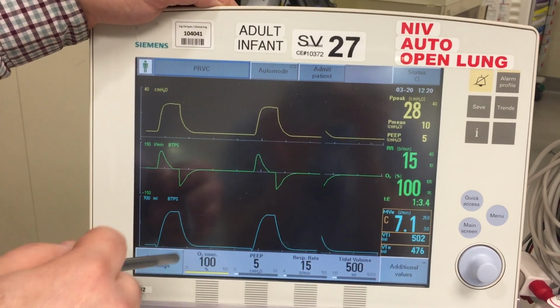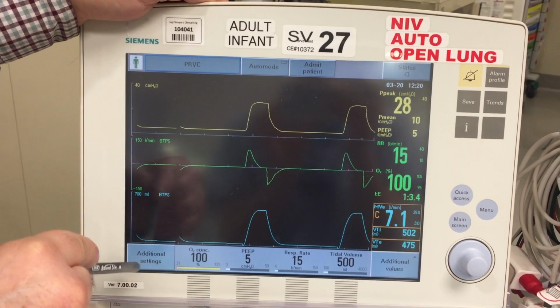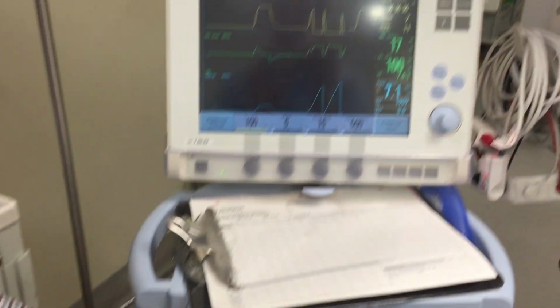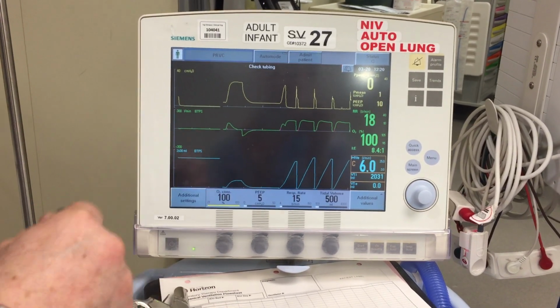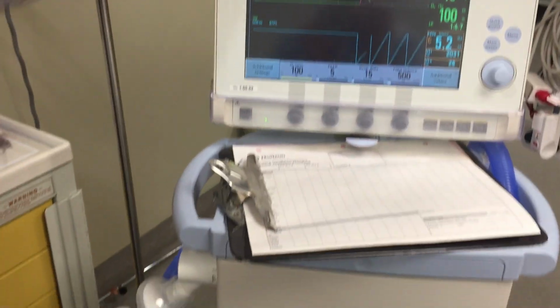Finally is our volume waveform, and what's important about this volume waveform is basically what goes in must come out, so we want to make sure that it's even so that there's no big leak. If we were to simulate a leak, for example, we would notice that we're really not getting a nice volume waveform anymore, and then of course the whole ventilator will go haywire because of leak alarms.